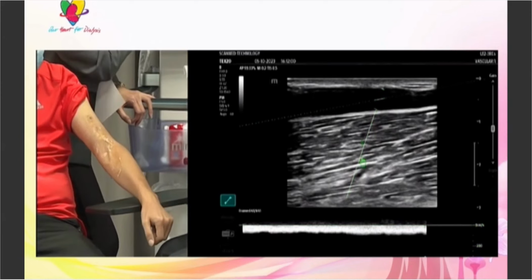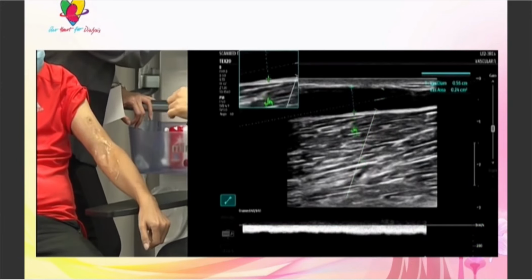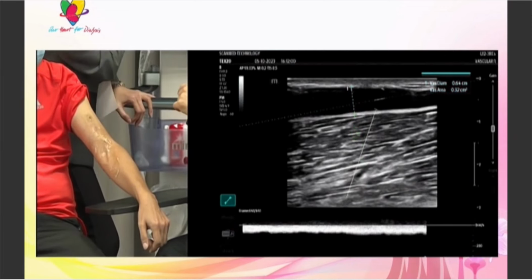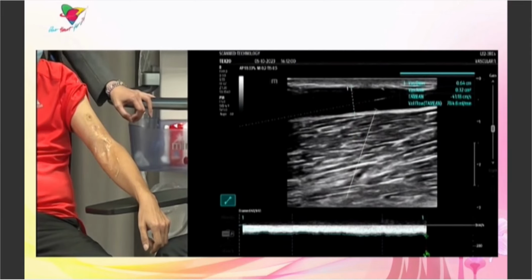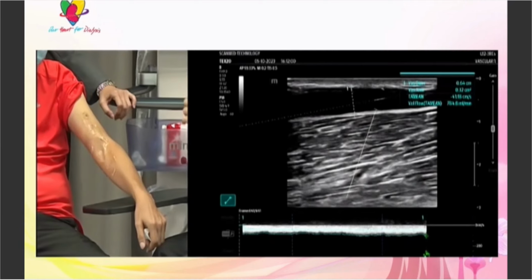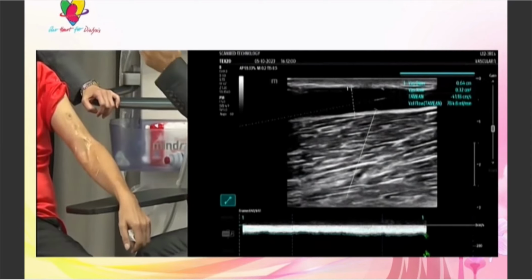And in my experience, the only reason why his cephalic works so well, although he has dual outflow with good basilic and good cephalic, is because his total flow is high. Usually, if it's basilic dominant and the flow is okayish, you see there is 800 in the cephalic, 600 in the basilic, so we have already 1,400.